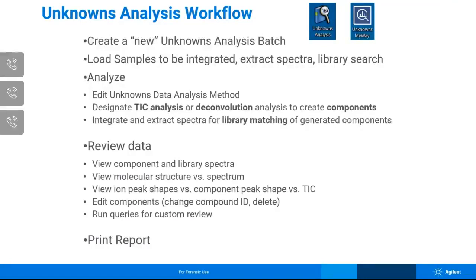Now, when you create a batch, you're going to, just as in ChemStation, create a data analysis method specifically for that batch. And you can load different unknowns data analysis methods in a batch and re-extract, re-deconvolute, re-integrate, all the different parameters, library searching, and things you can do multiple ways and multiple times within a batch.